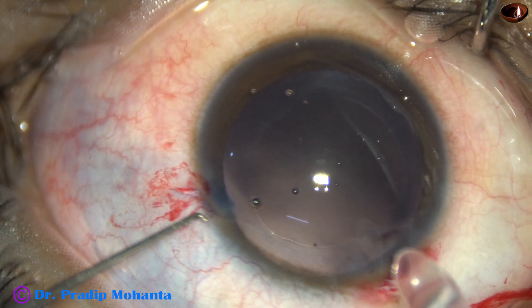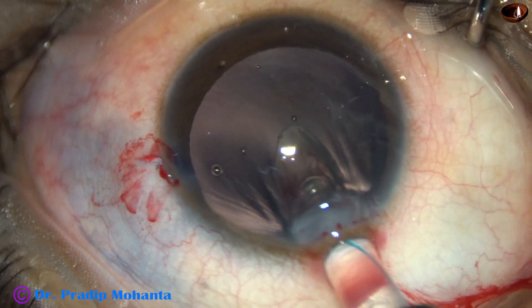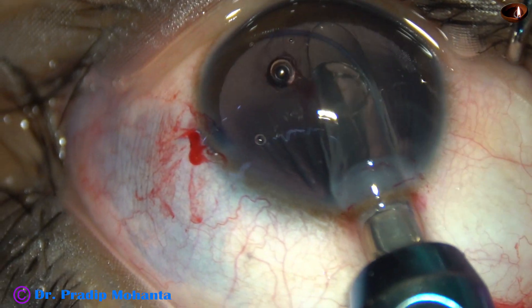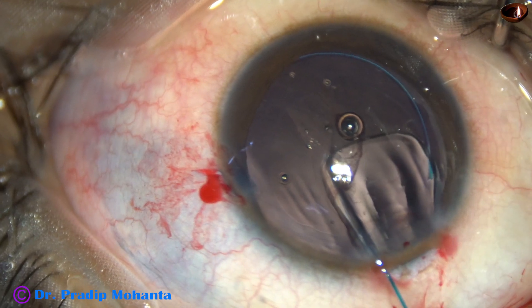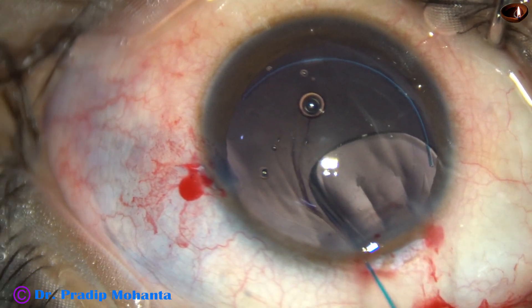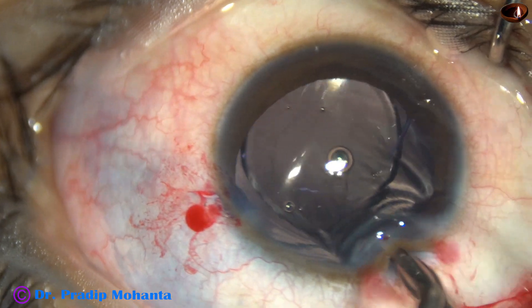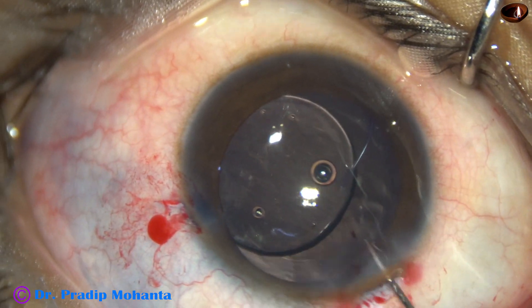The lens is placed in the sulcus. The reason is we may have to exchange this lens later on — if the eyeball becomes bigger or if there is a myopic shift, we may have to change this lens and put another. If the lens is in the sulcus, it is easier to remove. Multipiece lenses are very well tolerated in the sulcus.